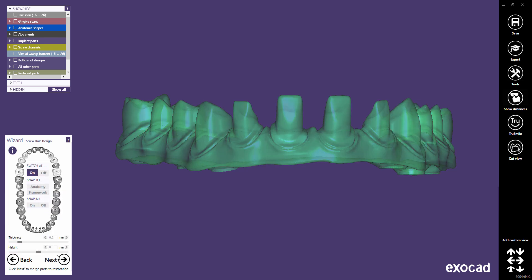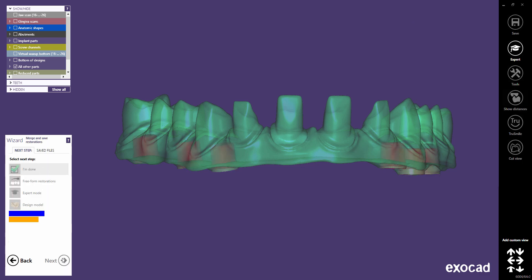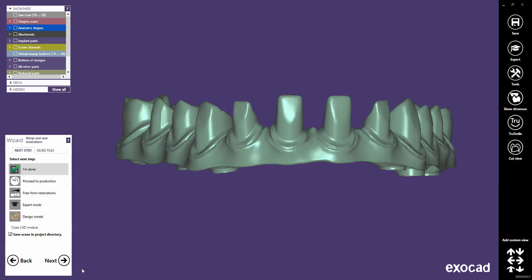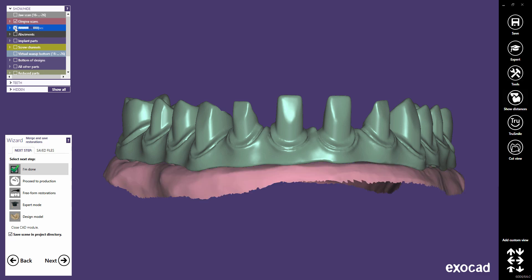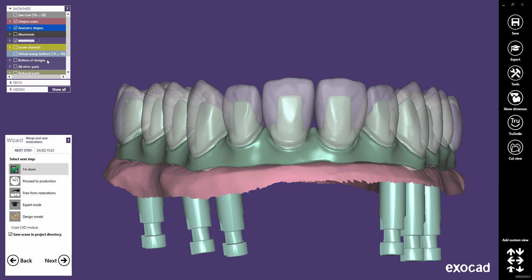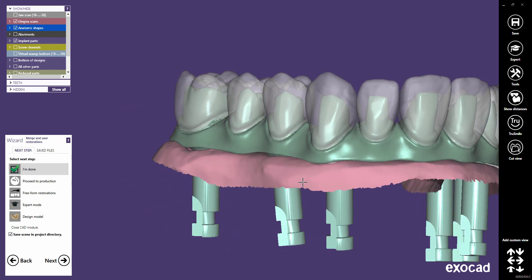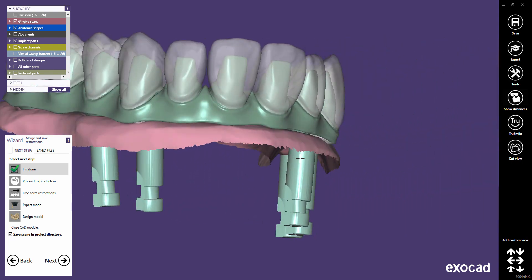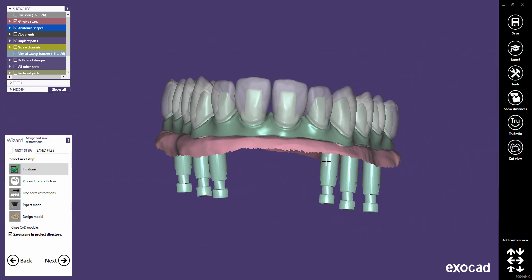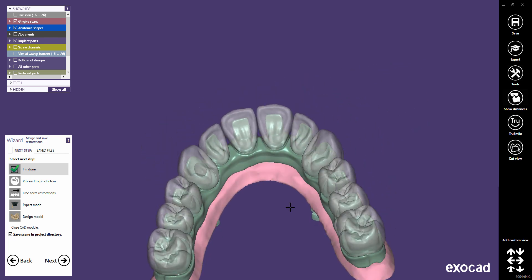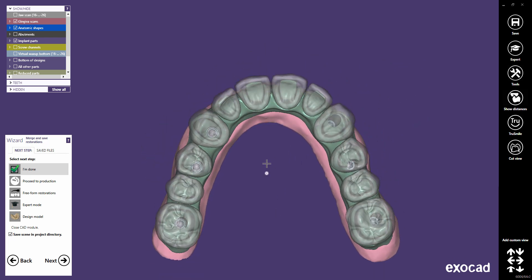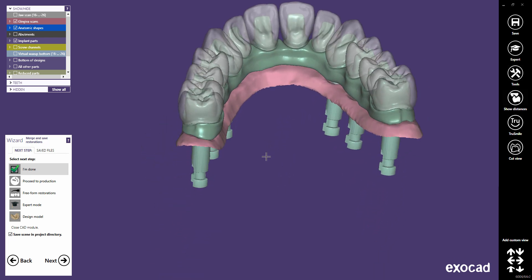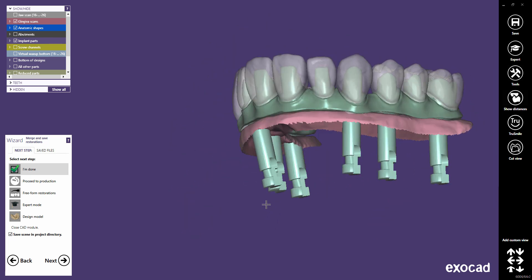Switch off all screw holes and click Next to finish the design. We created a nice thimble crown implant bridge in not even 10 minutes.